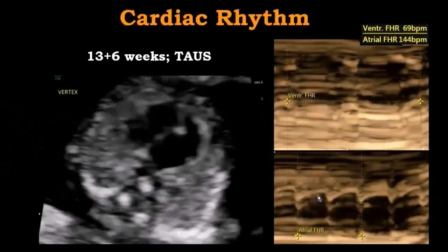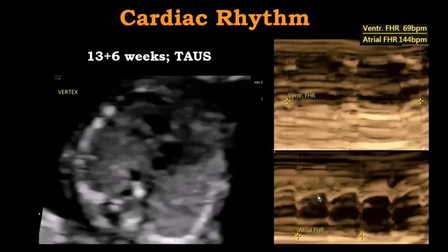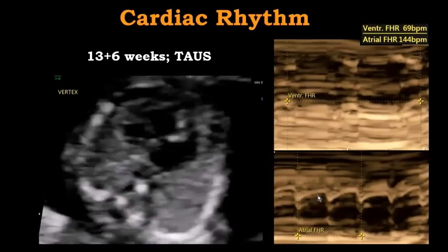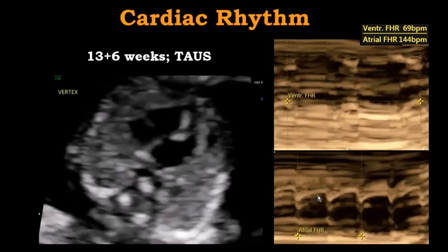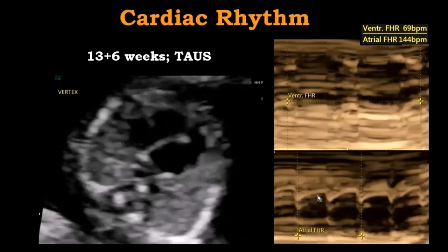So here is an example of an abnormal rhythm, and very often, if you don't utilize the assessment of the atrial and ventricular rate and just assess the heart rate even outside the heart, you may get controversial results, like you see the bradycardia and then the rhythm is normal.